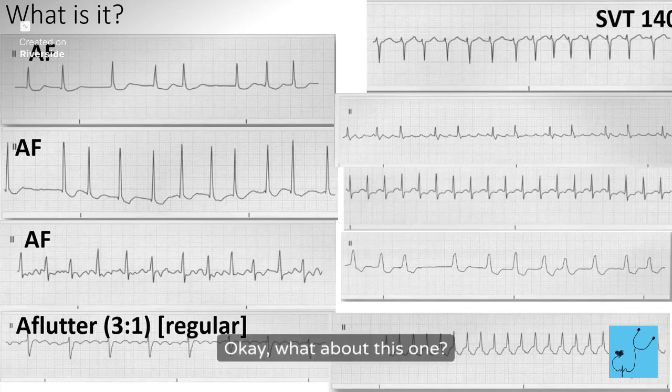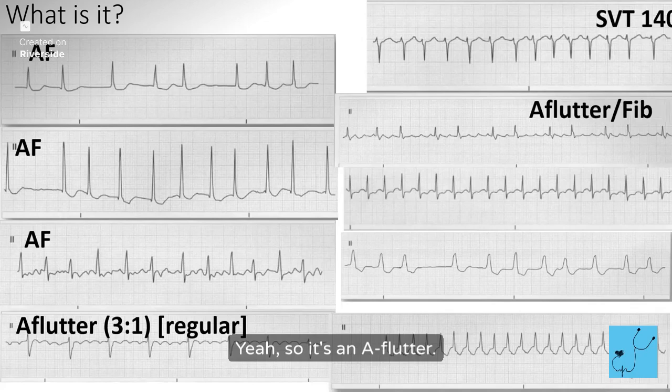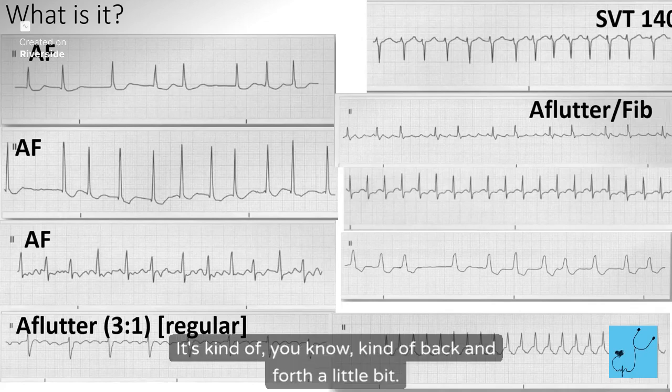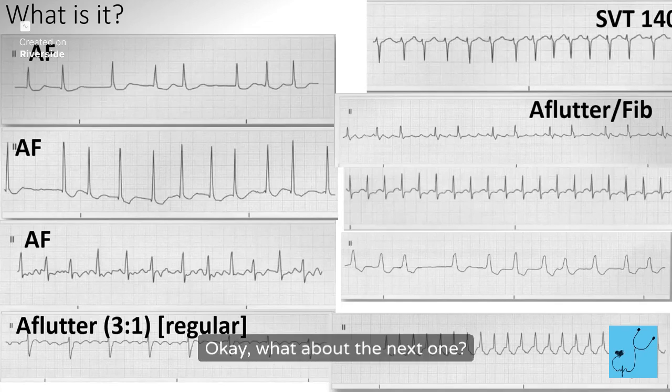Okay, what about this one? That's regularly irregular. Yeah, so it's an A flutter. It's kind of going back and forth a little bit. Yeah. Okay, what about the next one?